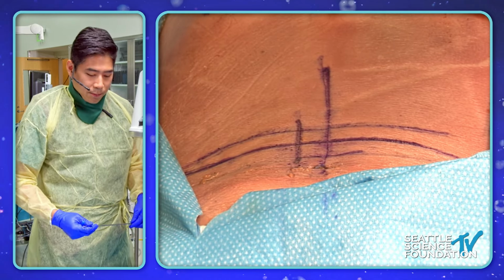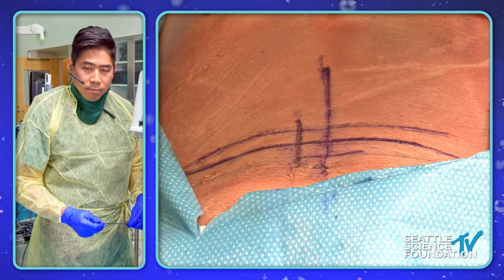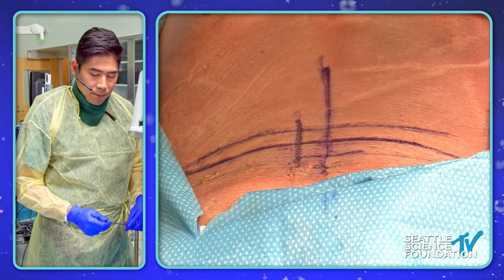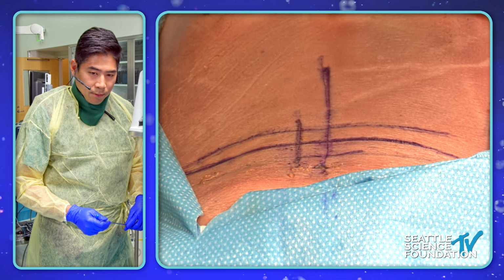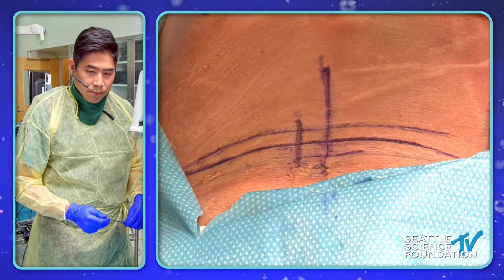John, quick question. Do you vary those distances according to the patient habitus? In other words, are you at the periphery of the pedicles with very large patients, or do you vary that with downward, upward migrated discs, for example?